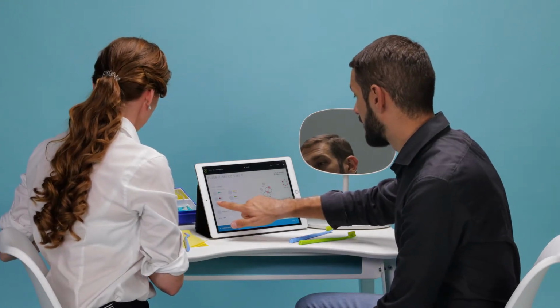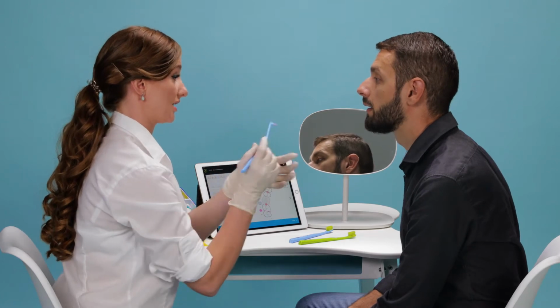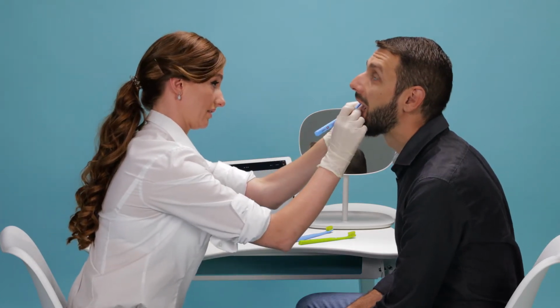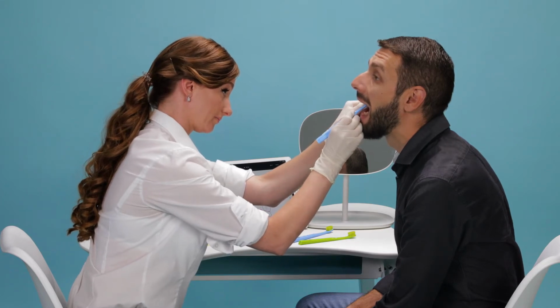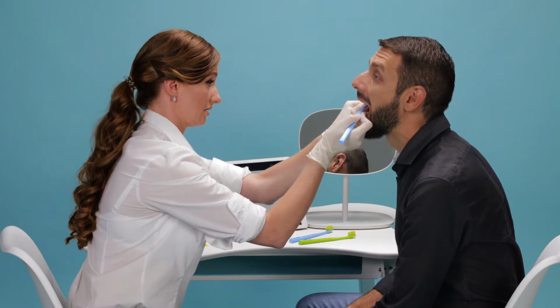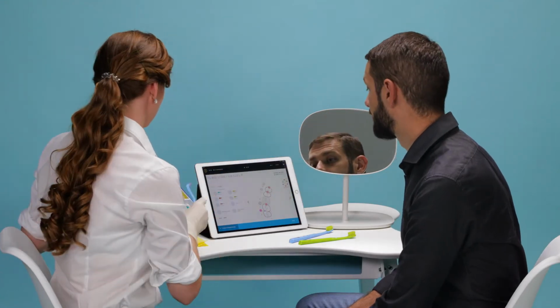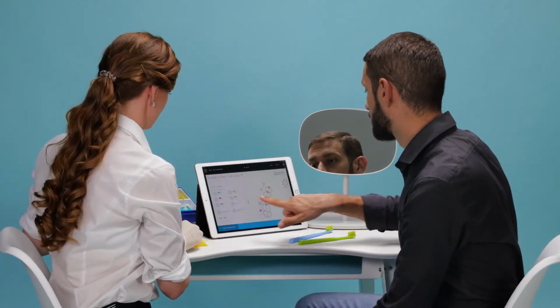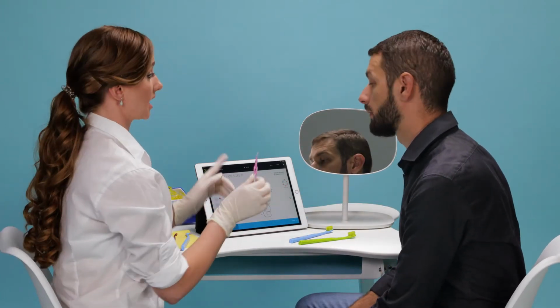Edward then interacts with the tablet and clicks the pink prime button. In the upper right sextant, I recommend a single tufted brush, as Edward has a large interdental space here. I demonstrate and remind Edward how to use this aid in that area. He then clicks the Others button to input this aid into the Bob score.